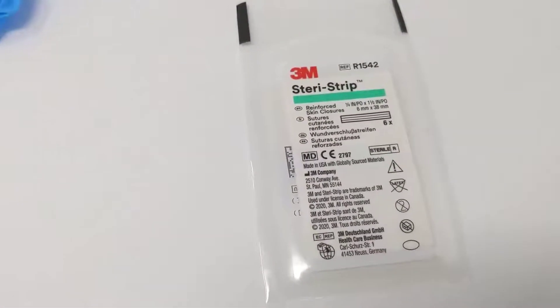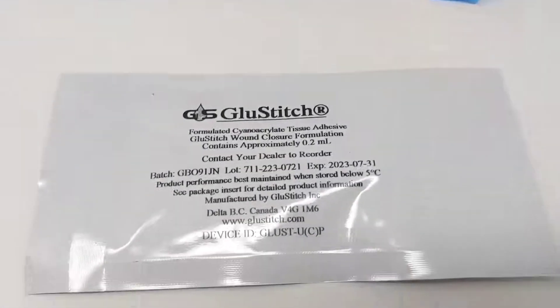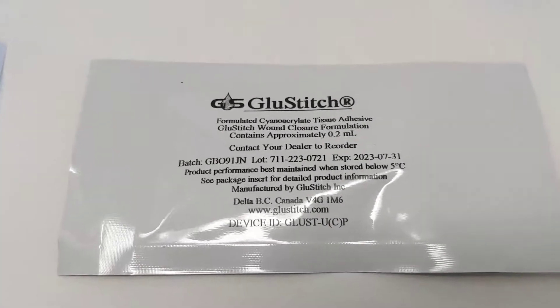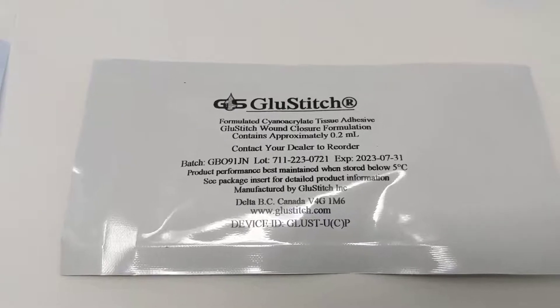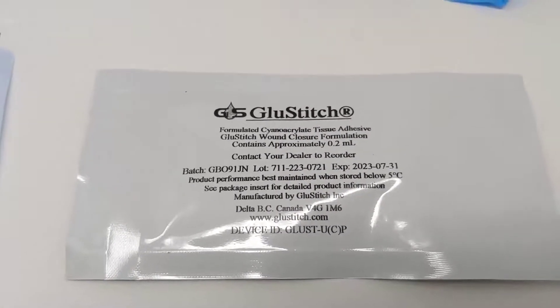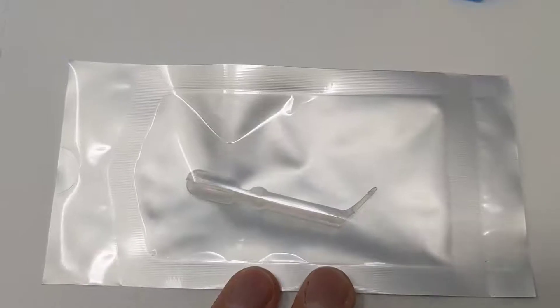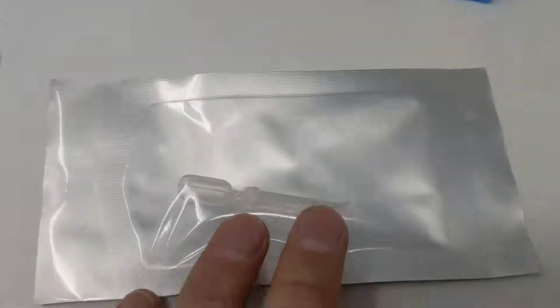And then you get a pack of 3M high quality Steri strips — so that's our basic kit. The advanced kit will also include glue stitch, which is a specially formulated glue for skin. This is very different than the hardware store super glue — it has a much higher elasticity and it is not cytotoxic to the skin like the hardware glue is. So you get a single package of this; it's sterile and specially formulated for actual use on closing wounds.